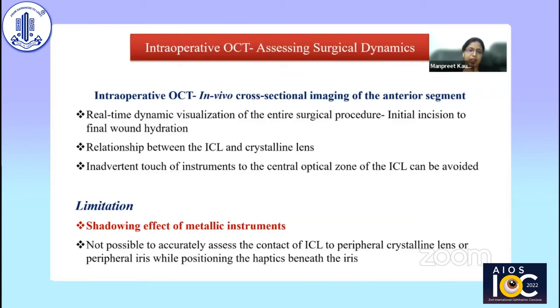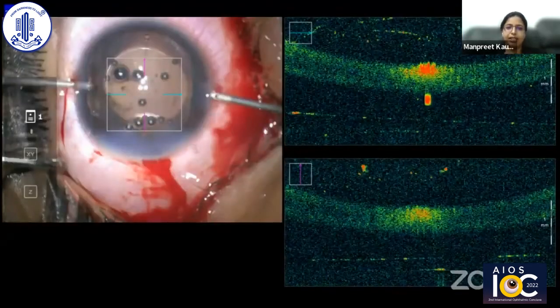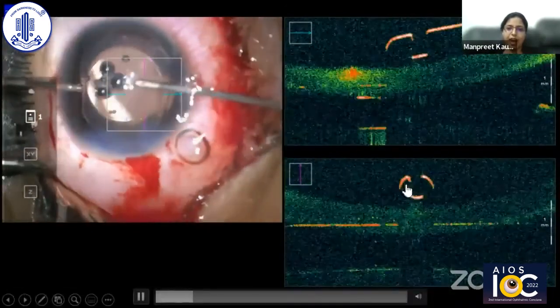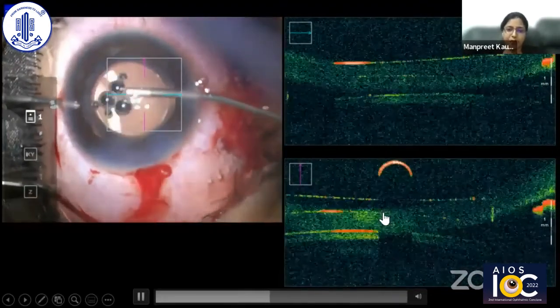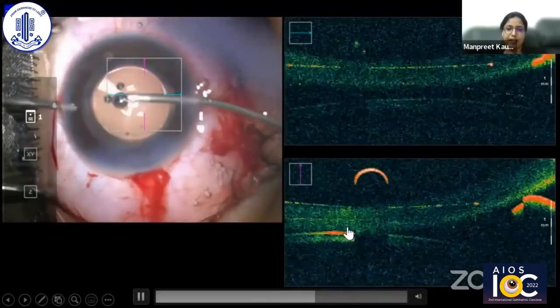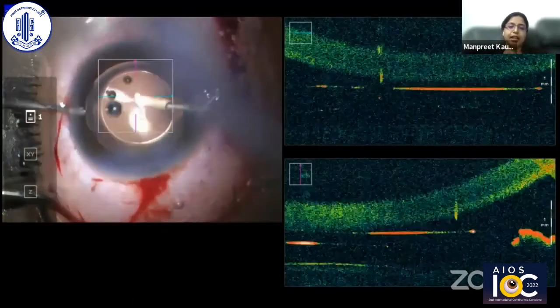Intraoperative OCT allows in vivo cross-sectional imaging of the anterior segment with real-time dynamic visualization from initial incision to final wound rehydration. The relationship between the ICL and crystalline lens can be seen, and inadvertent instrument contact with the ICL's central optical zone can be avoided. However, limitations exist: metallic instruments are not fully compatible with OCT image capture, causing a shadowing effect. It is not possible to accurately assess ICL contact with the peripheral lens or iris while positioning haptics beneath the iris, as instrument shadowing obscures that region.